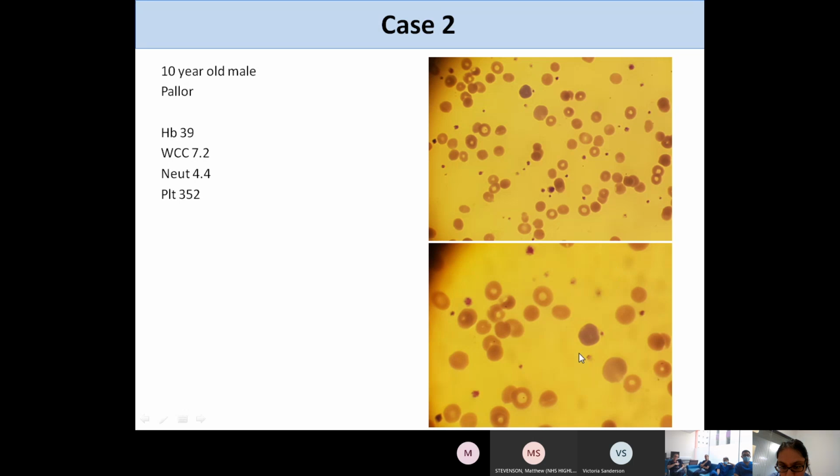So this is a reticulocyte with its pinkish blue staining. This is it up close. So you can see here a nice example of a spherocyte which has lost its central pallor, and a polychromatic cell here and a polychromatic cell here that just has a little bit of a bluey tinge to it. For this degree of anemia, one would expect if you have a functioning marrow that you'd be churning out a lot more of these polychromatic cells in an attempt to try and compensate for the severe anemia.